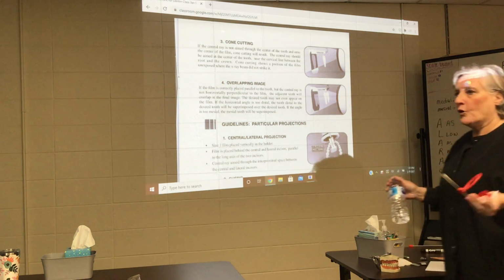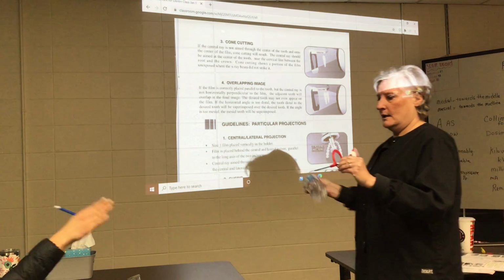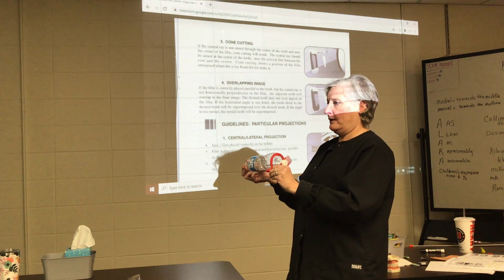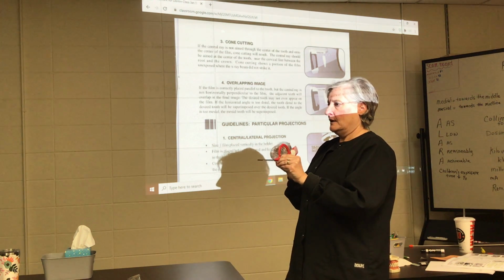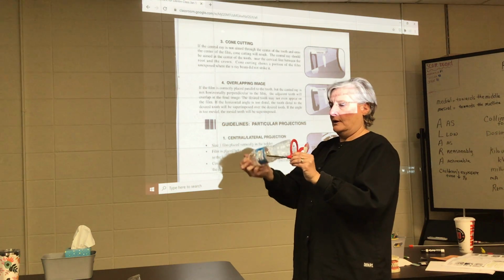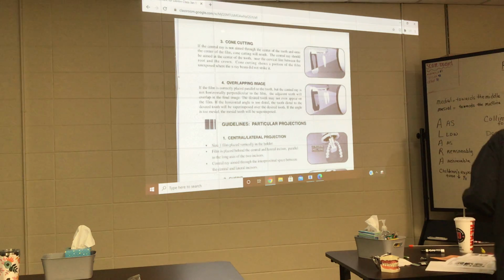So if I say it's a horizontal error, that just means it's not parallel with the arm. With the ring and the arm, it means it's not flush and parallel, okay? Horizontal error, it's too far to the right or too far to the left. Up and down is the vertical. Horizontal is side to side. Okay?